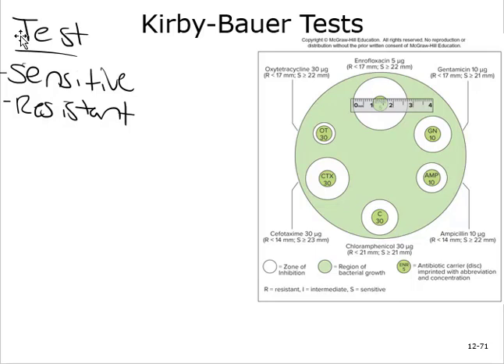And these tests are really important anytime we have a patient where the antibiotics are not working against the specific disease, or if we have a newly discovered pathogen and we need to find a treatment for it, we need to do these antibiotic tests.